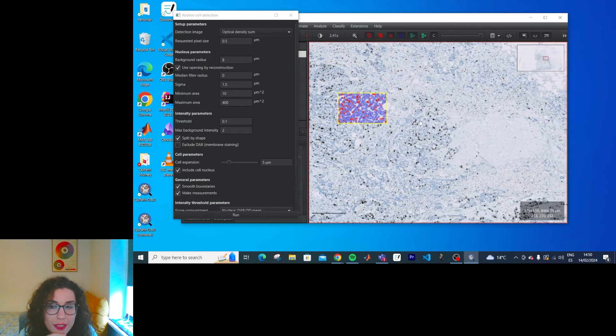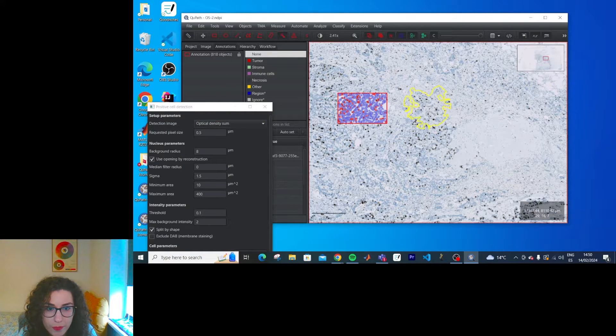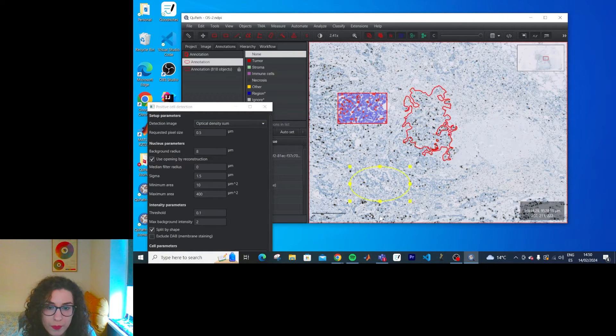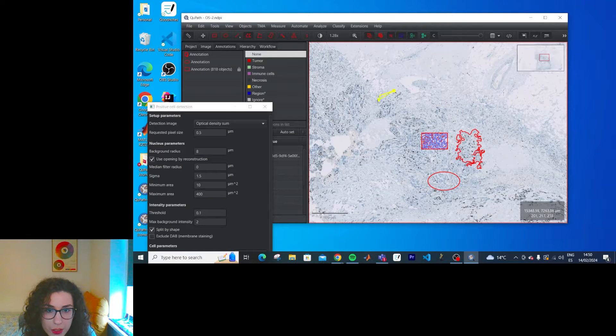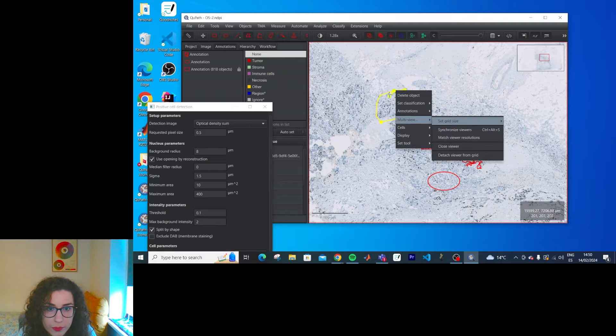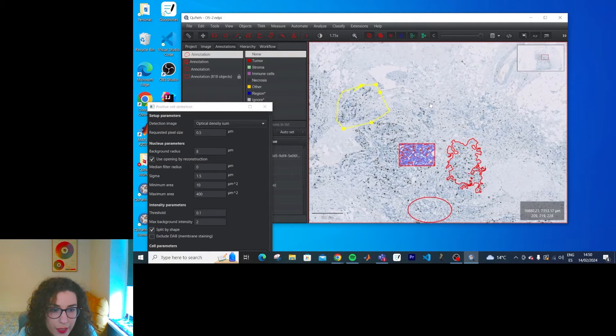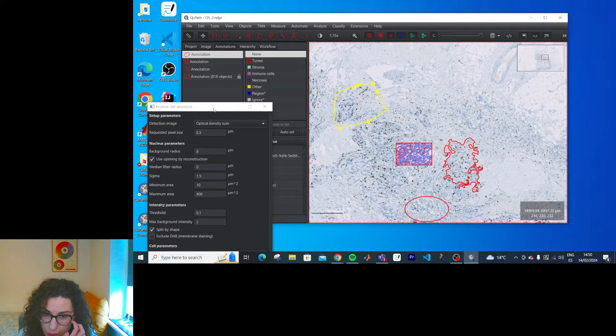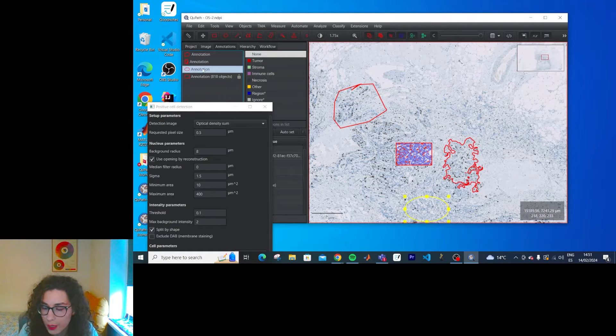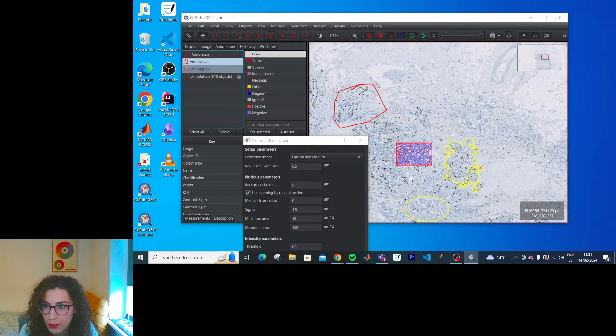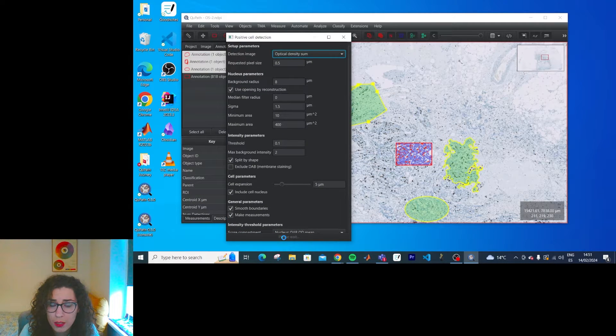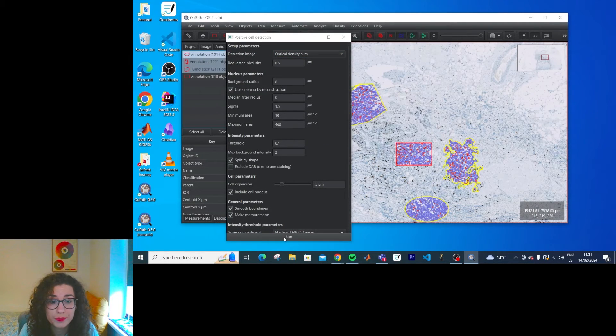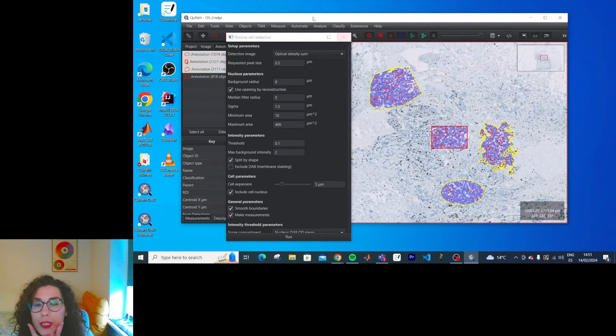Now if you have more areas of interest, let's paint a few of them. One here and I'm just going to use all the annotation tools. That's it. Stop. Double click. Forgot about that. And if I want to run this on all of them, not in the one I already have, can I select? If you press control, you can select them and then run. It works. Great.